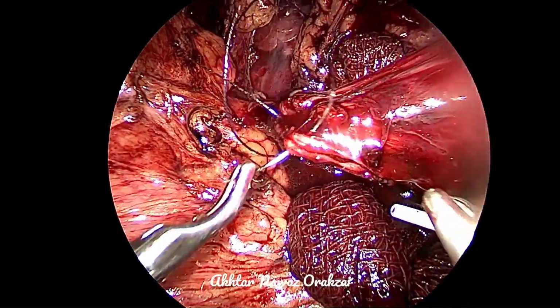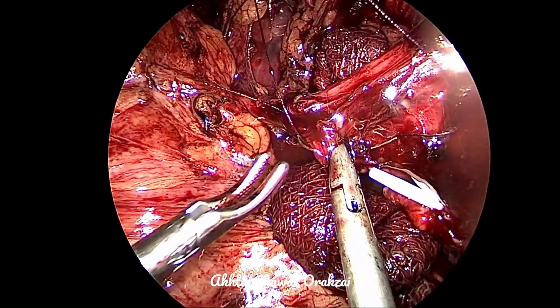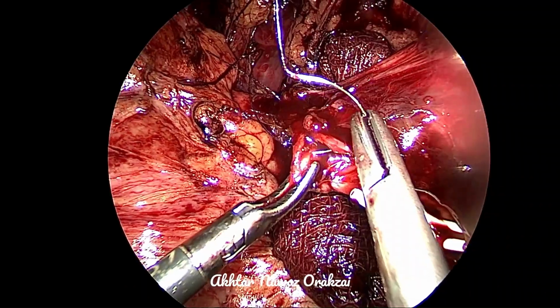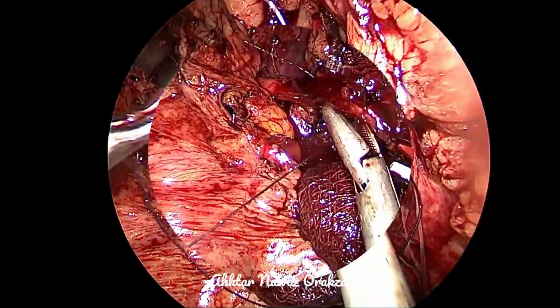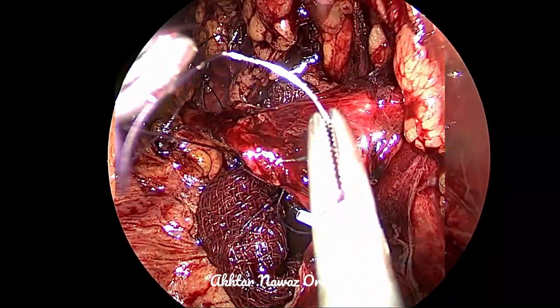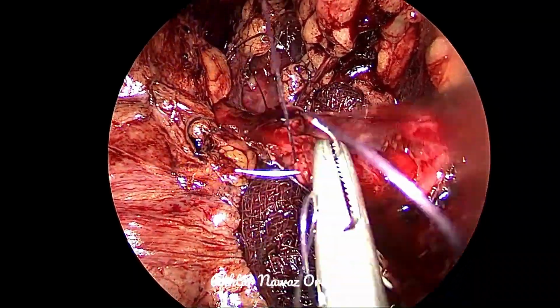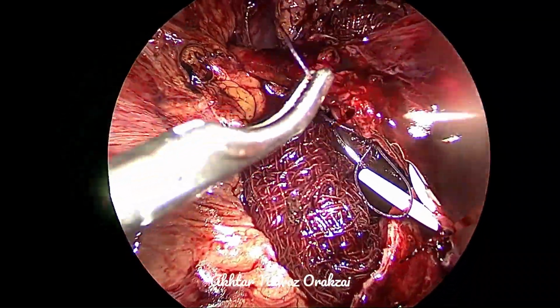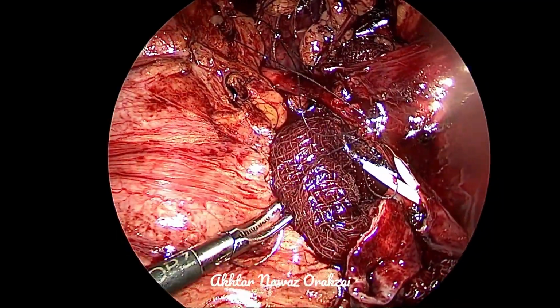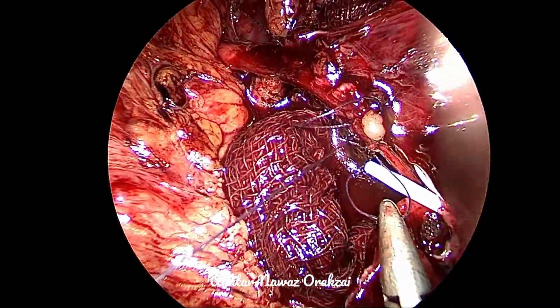So with this suture, we will reach up to the tip of the ureteropelvic anastomosis, and after we are done with the ureteric and pelvic anastomosis on the anterior wall as well, we may continue to stitch with the same suture up to the tip of the pelvis, or it's our choice whether we will continue and do the remaining pelvis from above downwards.